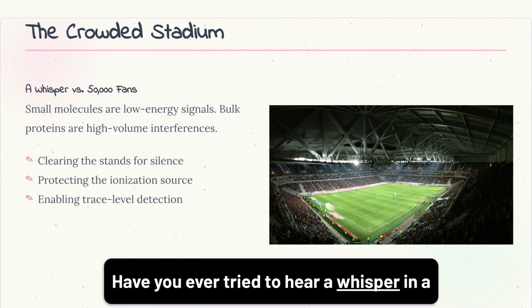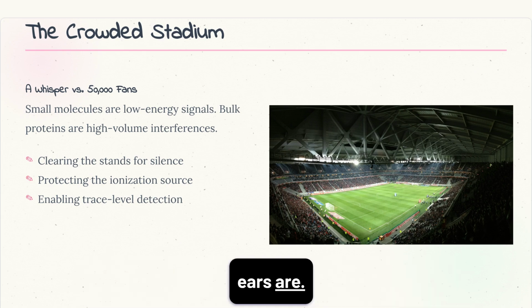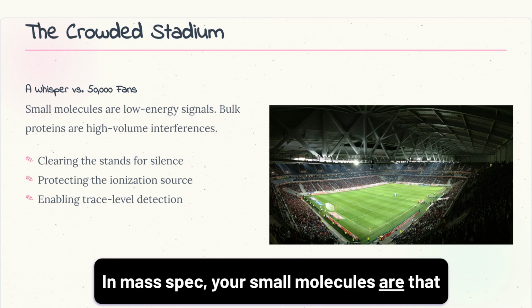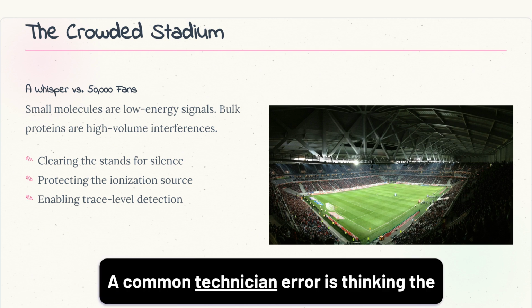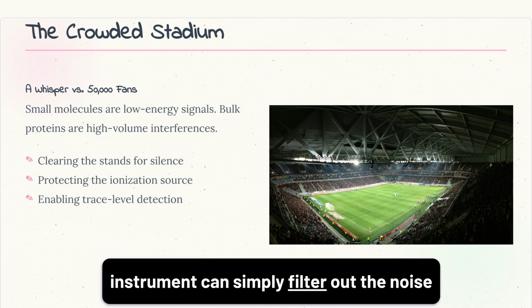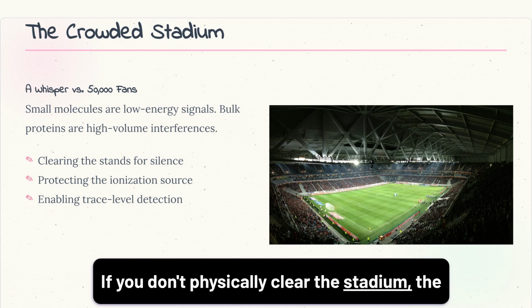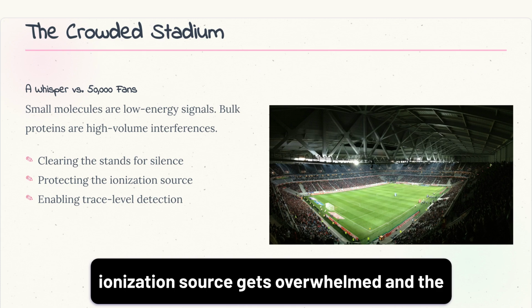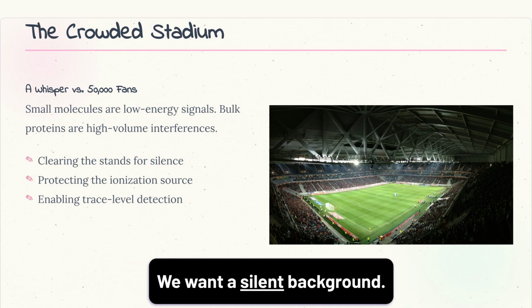Have you ever tried to hear a whisper in a crowded stadium? It's nearly impossible, no matter how good your ears are. In mass spec, your small molecules are that whisper, and the proteins are the 50,000 screaming fans. A common technician error is thinking the instrument can simply filter out the noise digitally. It can't. If you don't physically clear the stadium, the ionization source gets overwhelmed, and the signal is lost in the chaos. We don't just want a clean sample, we want a silent background.